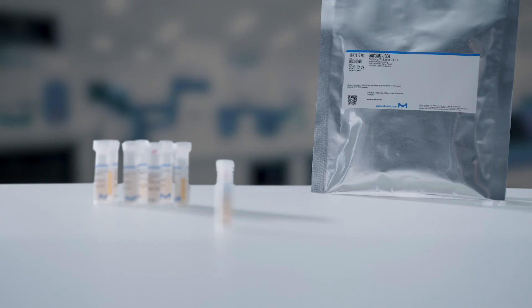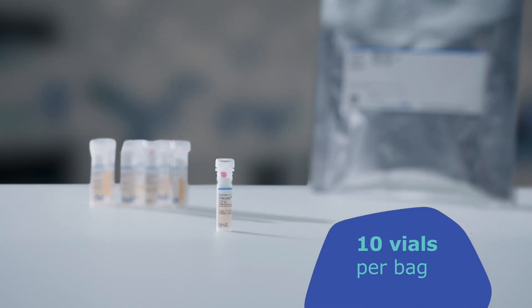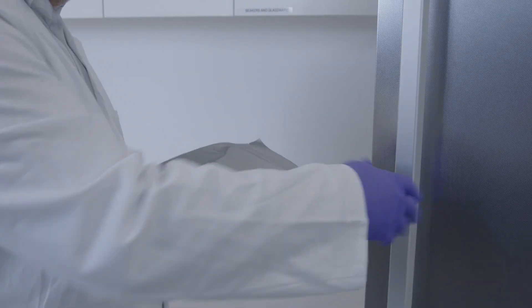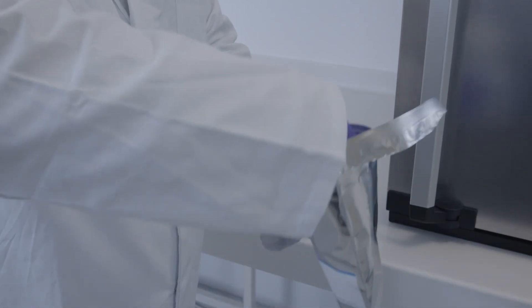The vials come in a waterproof mylar foil bag, each containing 10 vials. The bags can be stored at minus 20 degrees Celsius. When a disc is needed, open the mylar foil bag stored in the freezer and take out only a single vial.